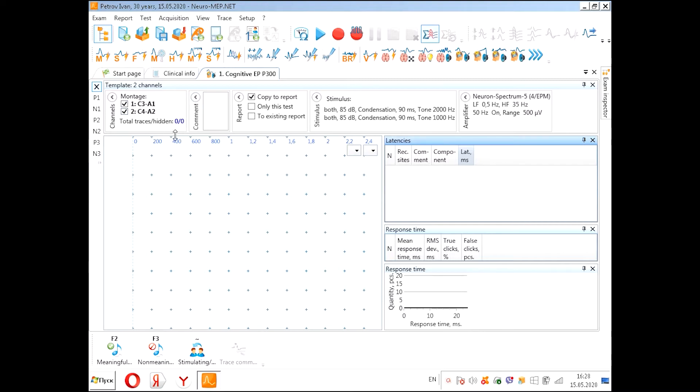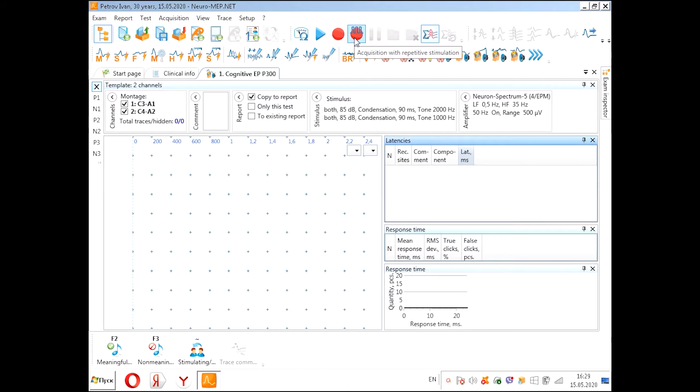Also you can change these parameters. For example, you can add some channels or use only one channel if you want. And after that you can start with stimulation.